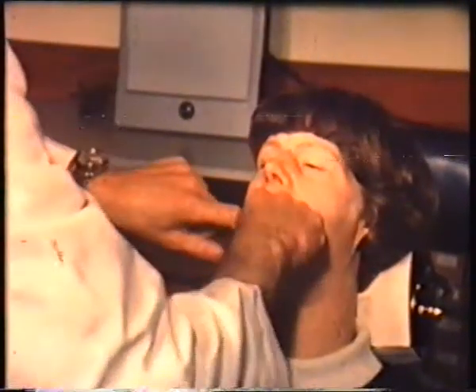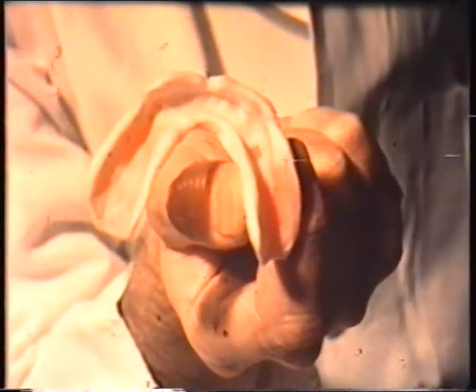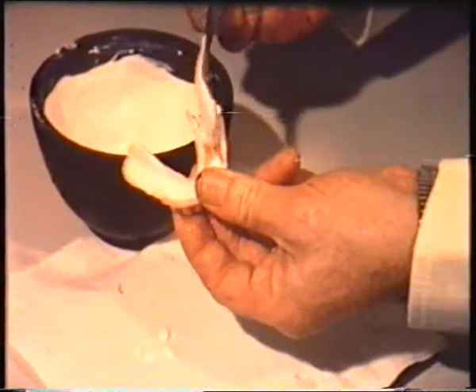At the end of this time, the patient reports that the retention and stability of the denture has been improved. The new fitting surface, developed by the functional impression material, must be inspected carefully. Should the material have been displaced completely from any area, then the acrylic resin-based material should be reduced in that area and a fresh layer of impression material applied.